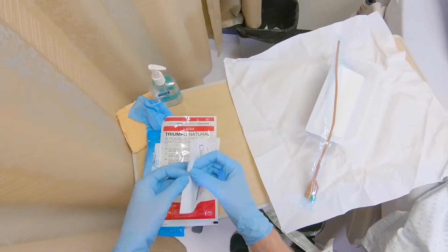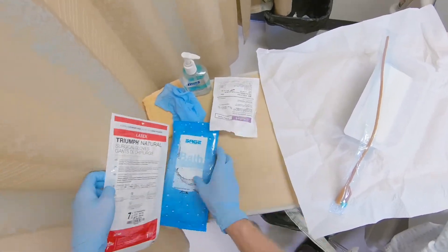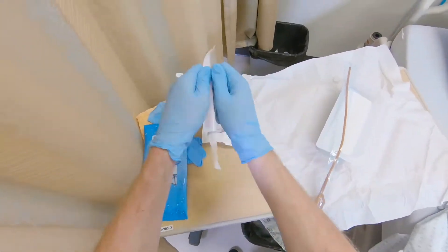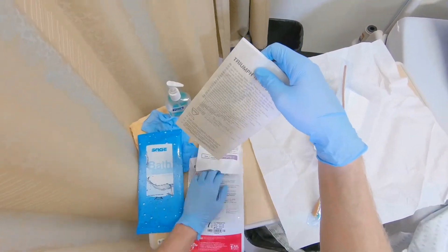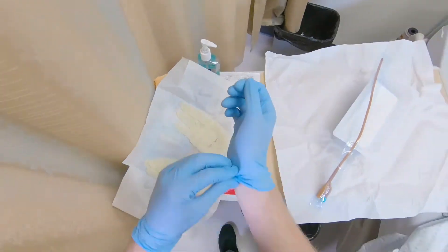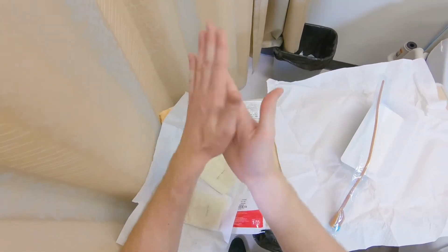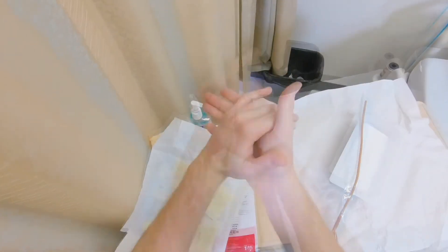Open catheter securement device package. Open sterile glove package. Then remove clean gloves and perform hand hygiene. Then put on sterile gloves.